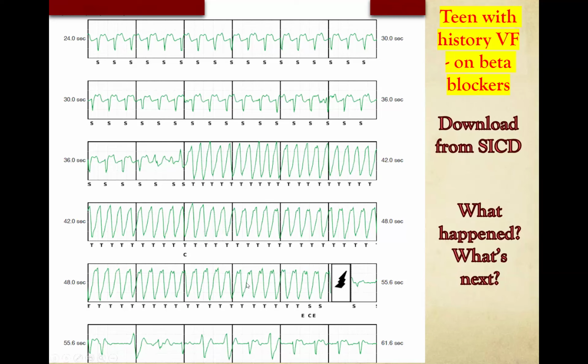And because of that, whenever anyone gets an SICD, before the device is implanted, we do tests of the electrocardiogram with the leads in different positions, trying to mirror what the system would see in the event that an SICD were implanted. And typically, there are 3 different vectors that the system can see.